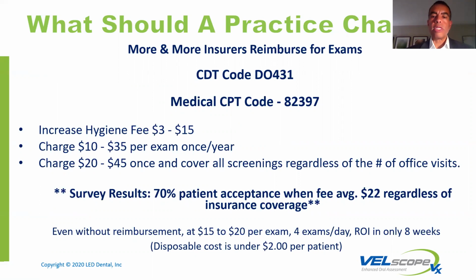But what's critical is to understand it really doesn't matter if insurance covers or not. What matters is the value to the patient, or the perceived value that the patient has of the technology and your fee. Normally we find that once you start hitting that $35 to $45 mark, you tend to see acceptance decline a little bit. On average, just doing a national survey, the average fees are a little over $22. But again, the fee isn't necessarily as important as the value, and obviously how adamant, if you will, you are when it comes to how important you believe it is to the patient to have this examination.